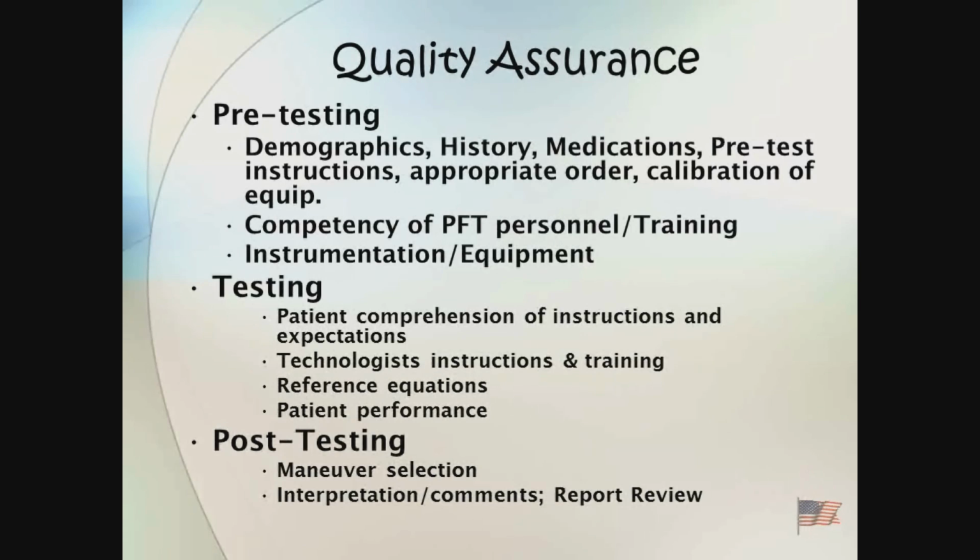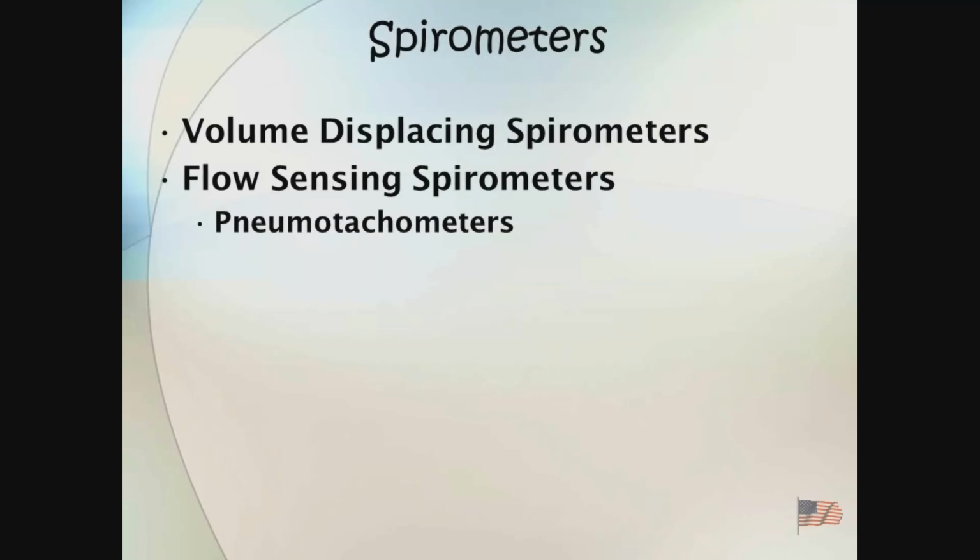Then as far as the testing, there's quality as far as the appropriate instructions that are there, looking at the appropriate reference equations, and in post-testing, looking at the interpretation being appropriate for that diagnosis. So let me talk a little bit about the different kinds of spirometers that you're going to encounter, and this is probably the deepest we will get related to that.